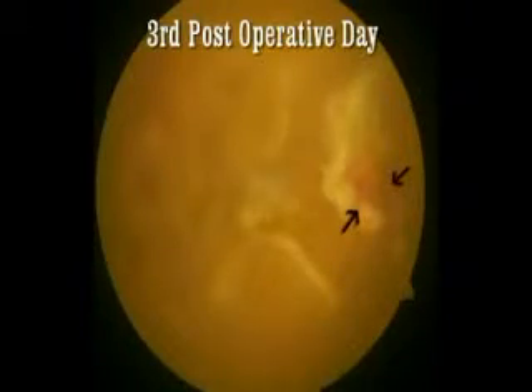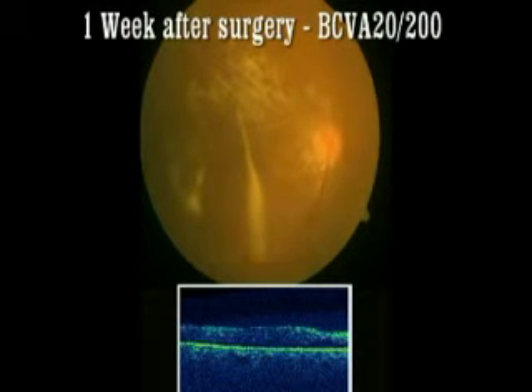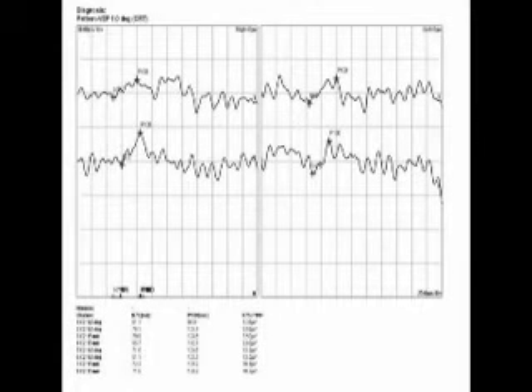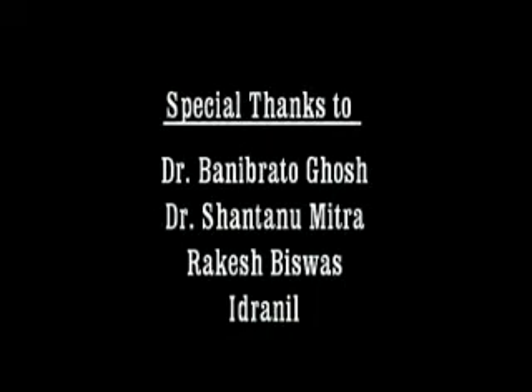On the third post-operative day we can see a partially absorbed membrane under oil, and on the first week the membrane is totally absorbed. After 8 weeks of surgery the BCVA is 20/80, and the VEP also shows a very good response post-operatively.